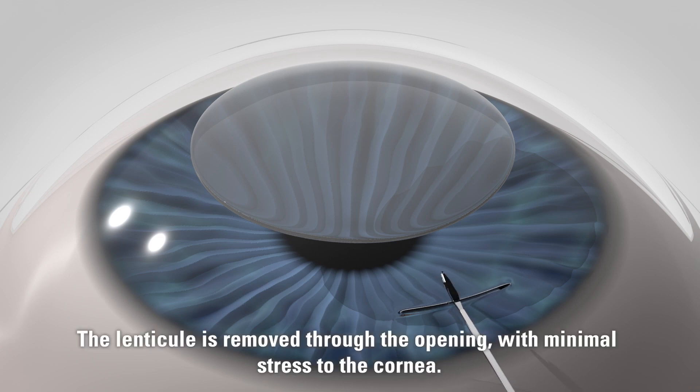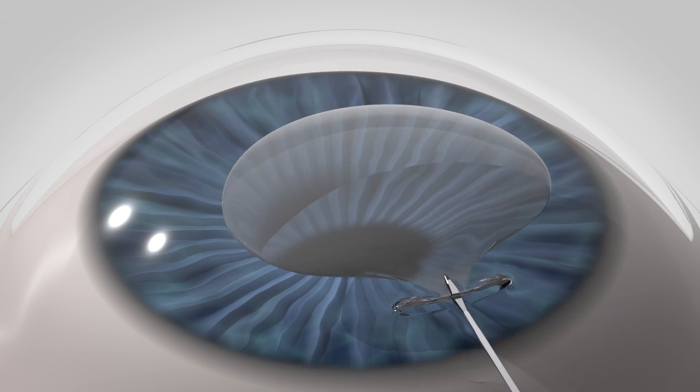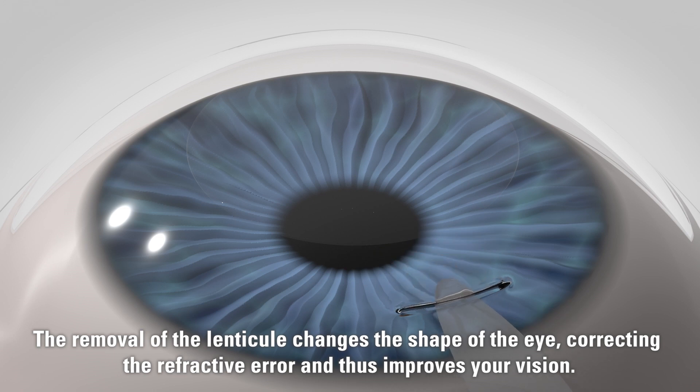The lenticule is removed through the opening with minimal stress to the cornea. The removal of the lenticule changes the shape of the eye, correcting the refractive error, and thus improves your vision.